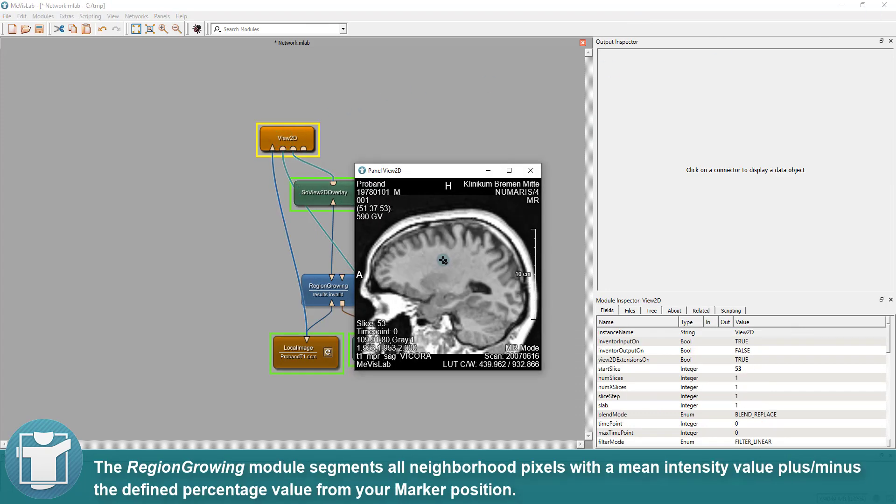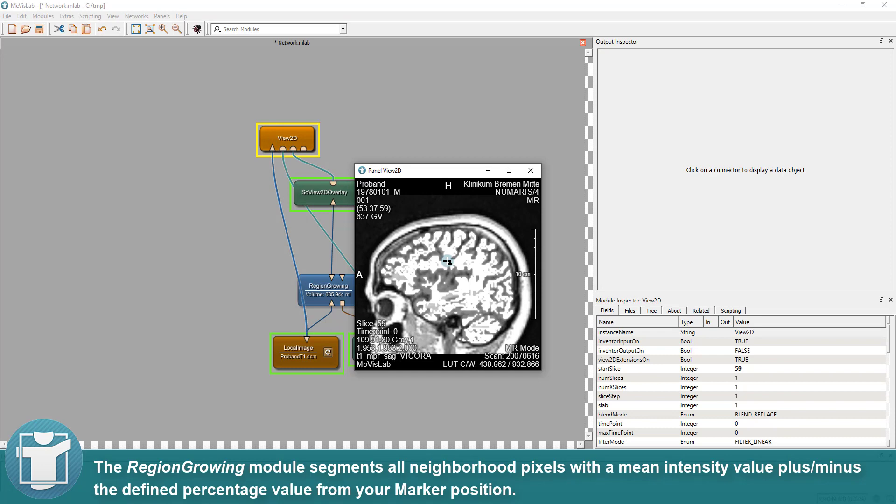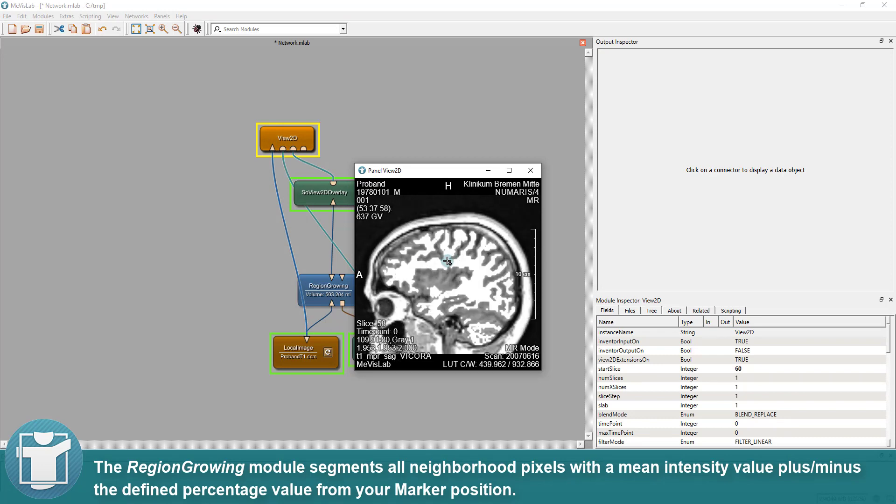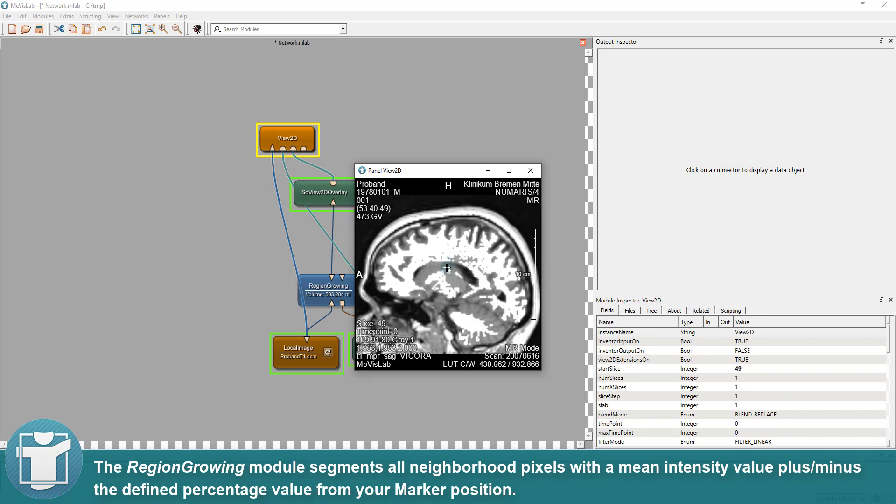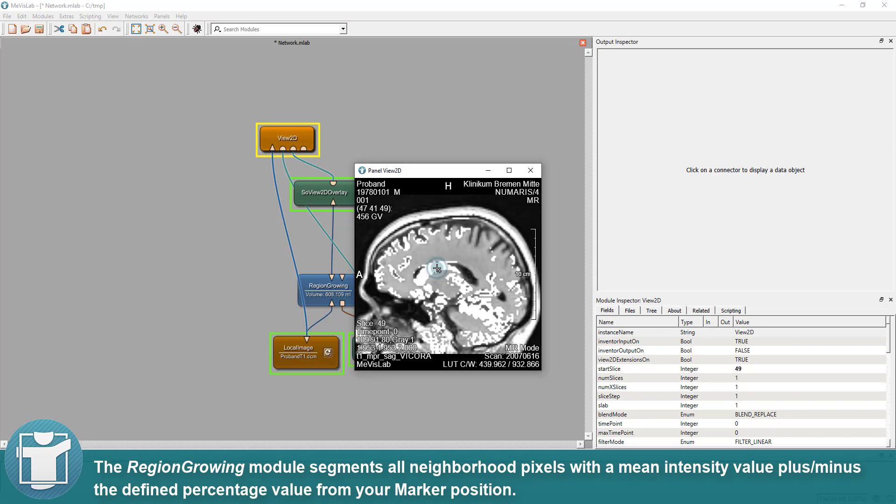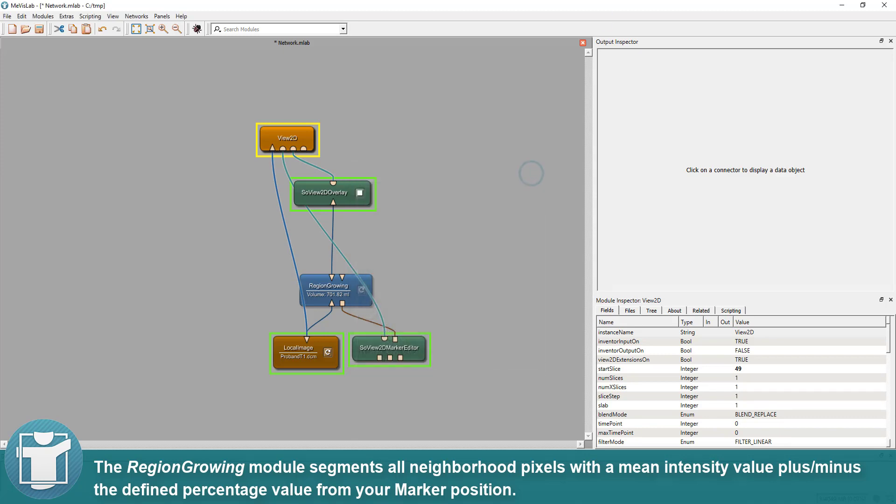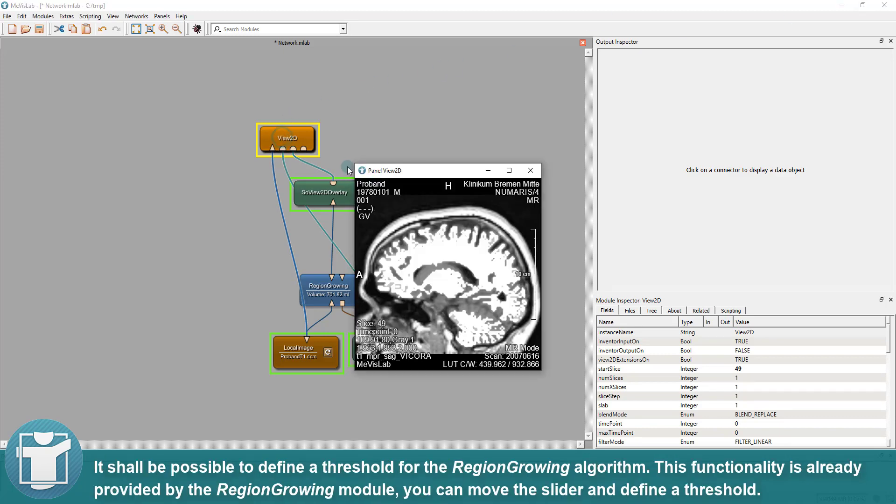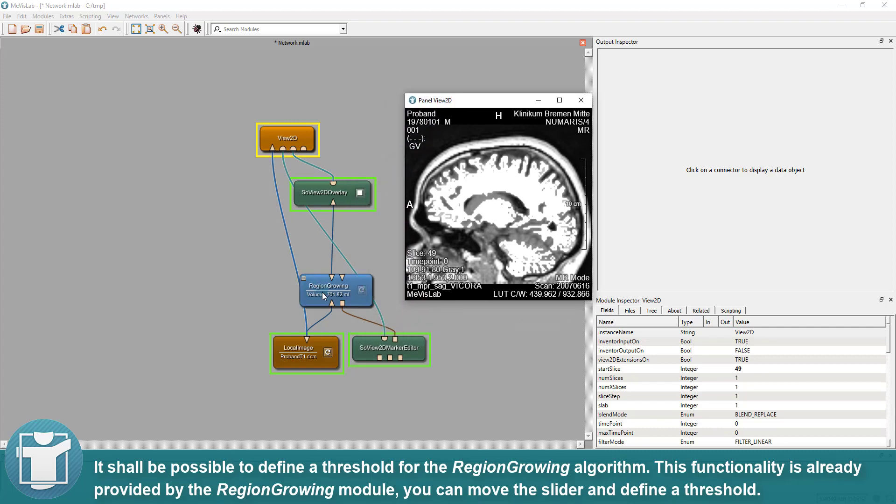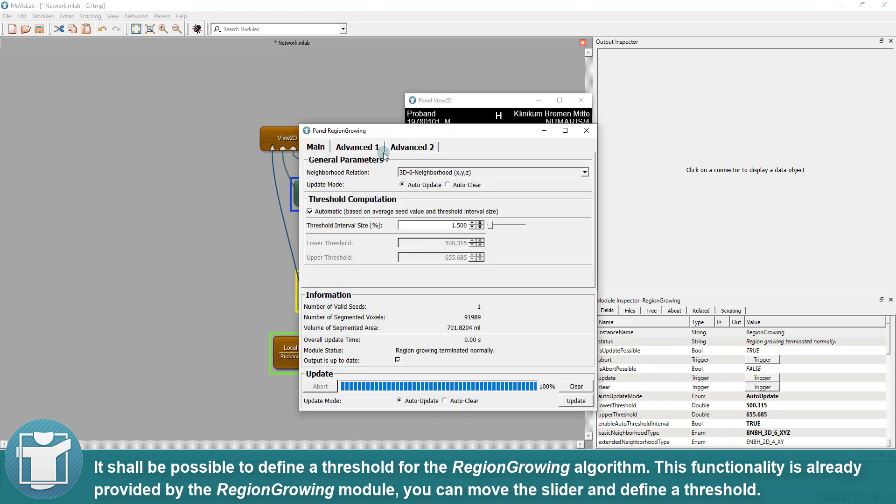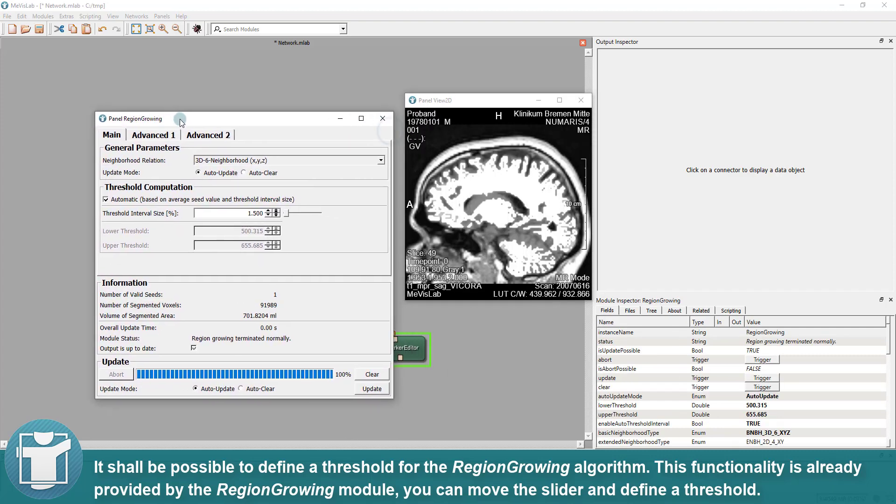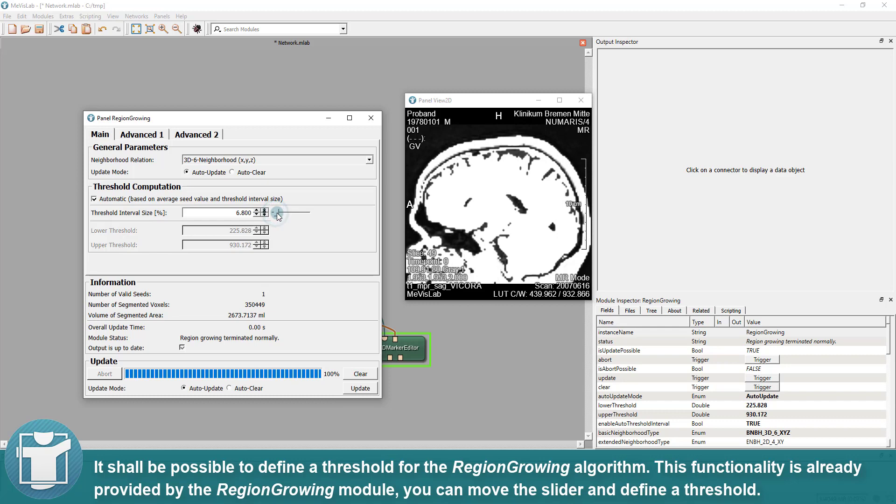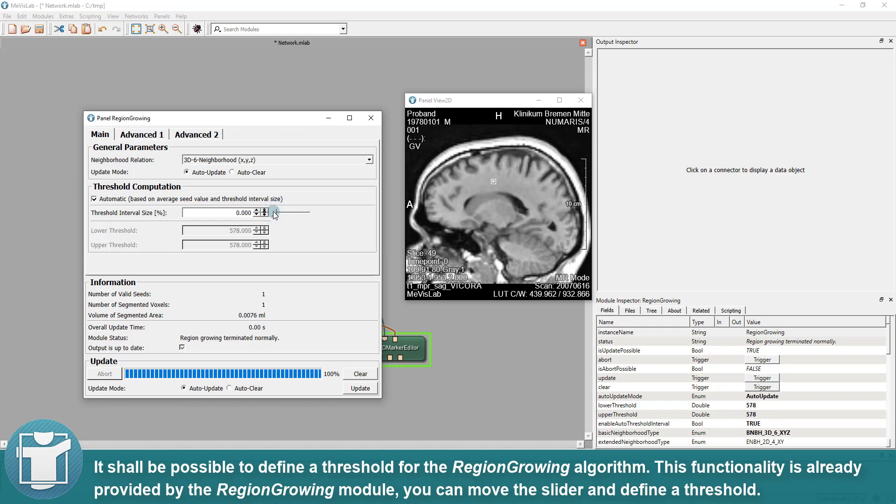If you now click into your loaded image with a left mouse button, the region-growing module segments all neighborhood pixels with a mean intensity value plus minus the defined percentage value from your marker position. It shall be possible to define a threshold for the region-growing algorithm. This functionality is already provided by the region-growing module. You can move the slider and define a threshold.